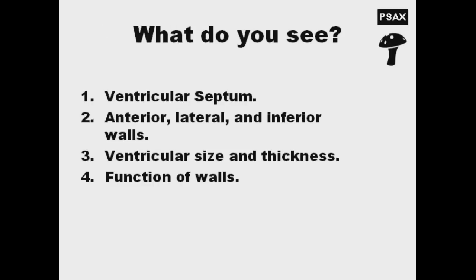The left ventricle is the most massive structure of the heart, and a majority of the heart pathologies are about the function of the left ventricle. This view is an orthogonal plane with the parasternal long-axis view, and adds more valuable information to the left ventricular study.